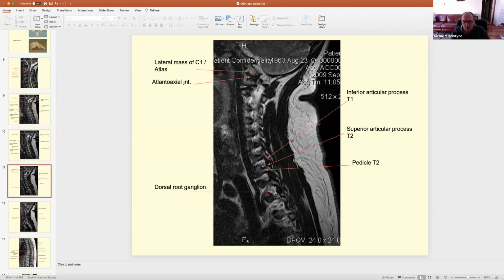And sometimes in MR, in the last couple of years, there has started to be a routine scan where we do oblique scans to those nerve roots, so we can see the compression on those nerve roots as they exit. You can see that dark nerve root in amongst the bright fat. Even though it's a T2, there might be a little bit of water there, but that's still fat, because fat is still bright on a T2.